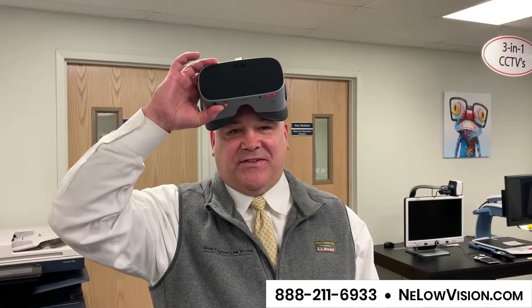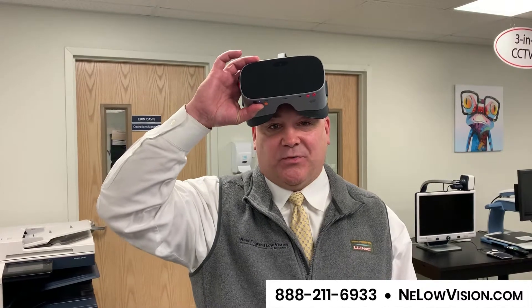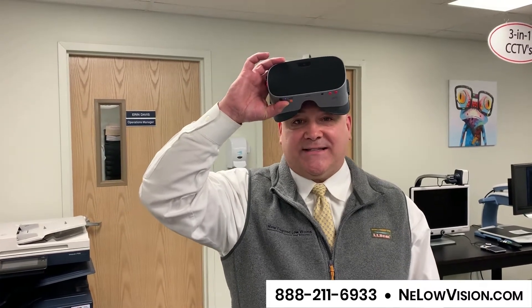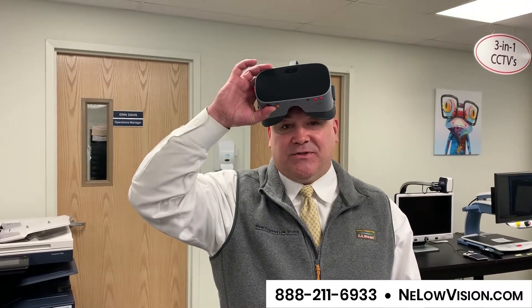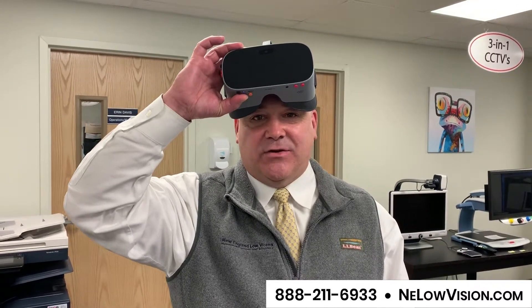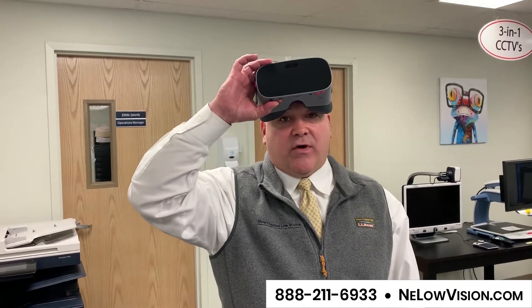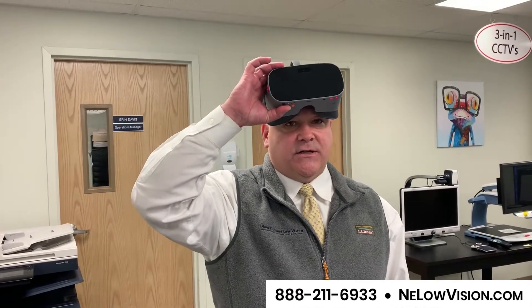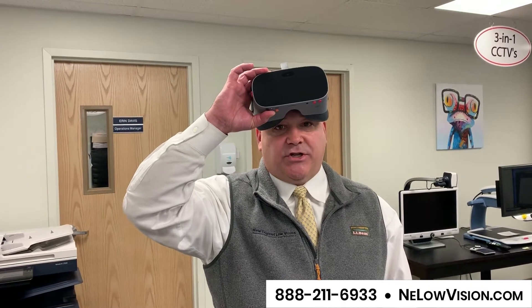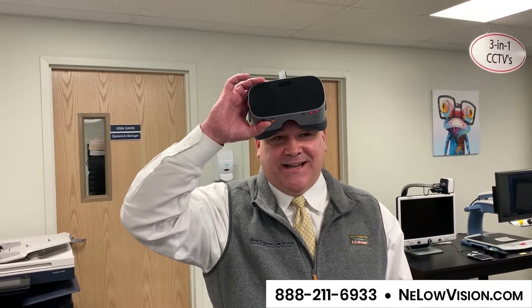Hey guys, I have an interesting device on my head tonight. This is a really cool wearable called NuEyes E2 — NuEyes is spelled N-U-E-Y-E-S. What I like about this is you can stream video right to the device or watch video at a distance. I'm going to try to show you both of them right now, step by step.